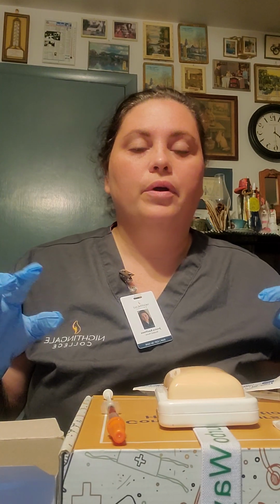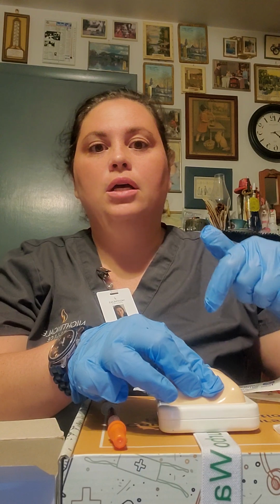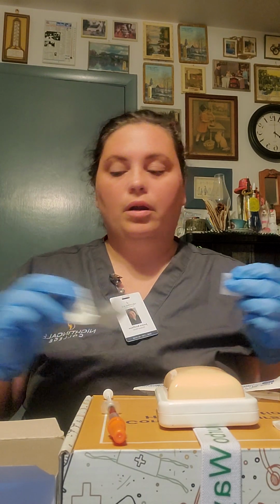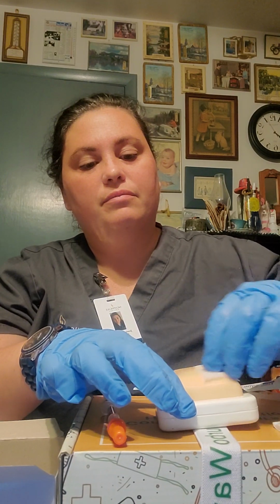Okay, so for sub-Q, I would first inspect my area, make sure that there's no redness, no irritation. I would palpate the skin, make sure there's not any hard spots. I would then pinch to make sure my needle is at least half the length, and it is. So I'm good to go there. And then I'm going to clean my area. I'm going to clean from the inside out, going about 2 inches.